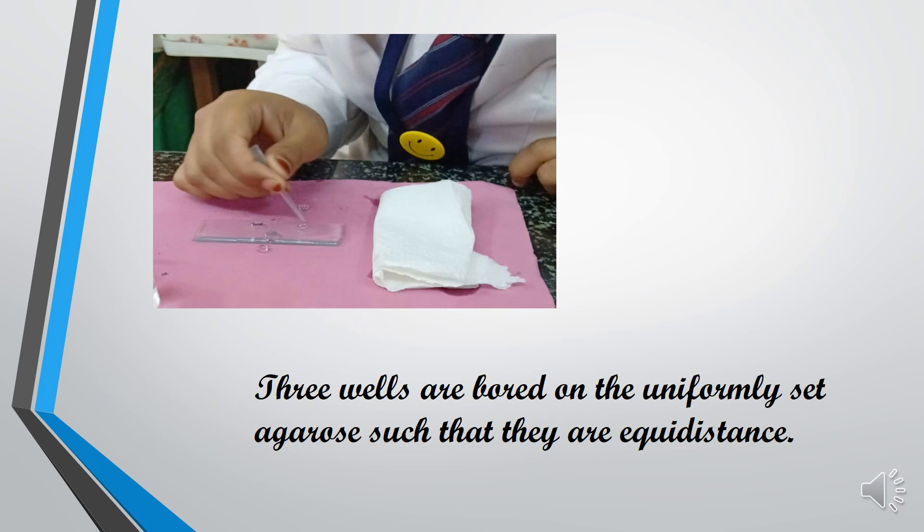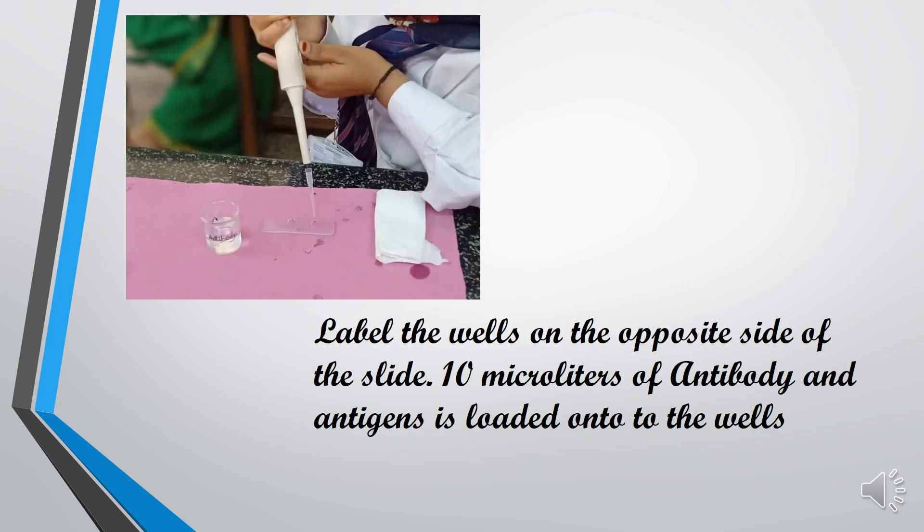Three wells are punched on the uniformly set agarose such that they are equidistant. Label the wells on the opposite side of the slide. 10 microliters of antigen from different species is loaded into the two wells, and a known antibody is loaded onto the third well just below the antigen wells to form a triangle.